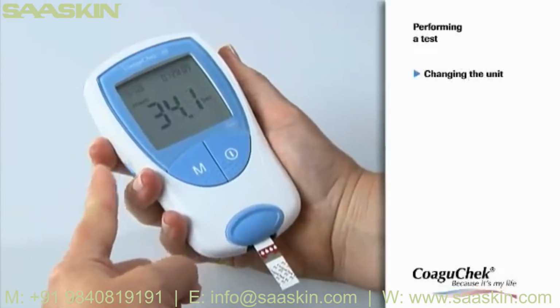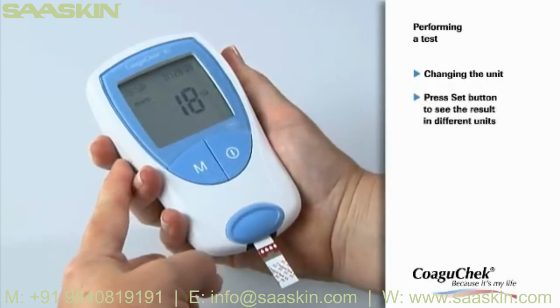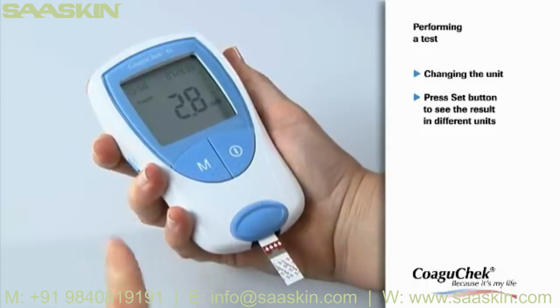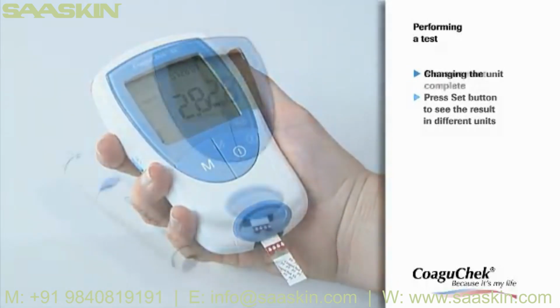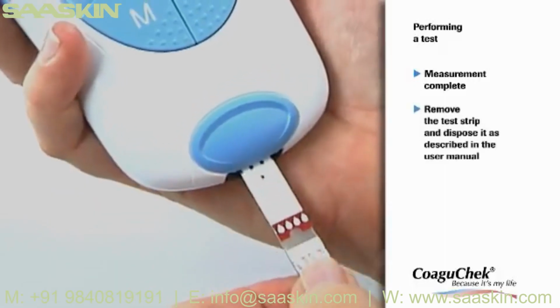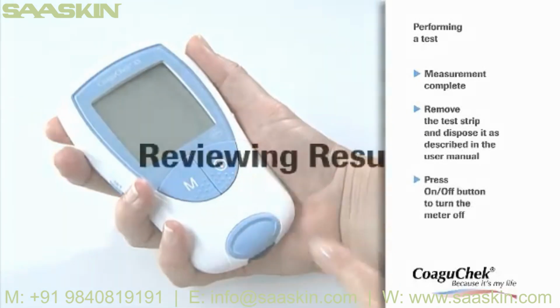Now you can change the unit if you wish by pressing the Set button. The result of the actual measurement is displayed in the INR value, in seconds, or in the quick value. Congratulations, you have successfully completed the measurement. Please remove the test strip and press the On/Off button to turn the meter off.